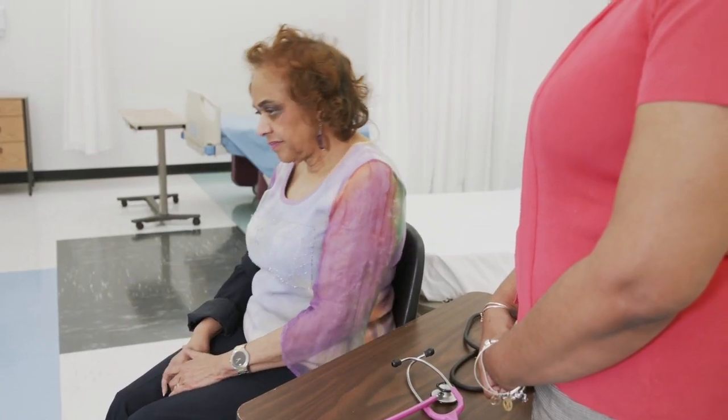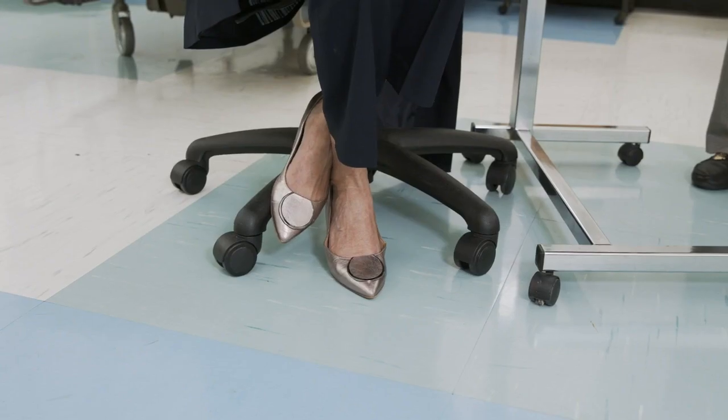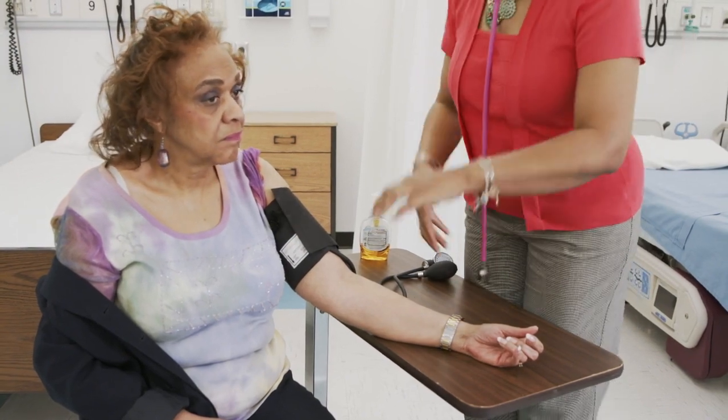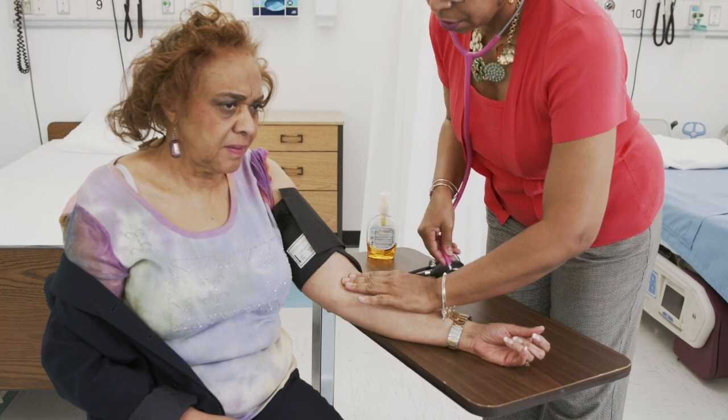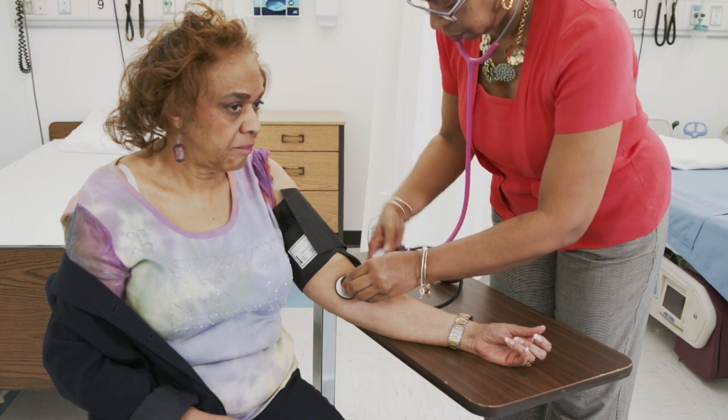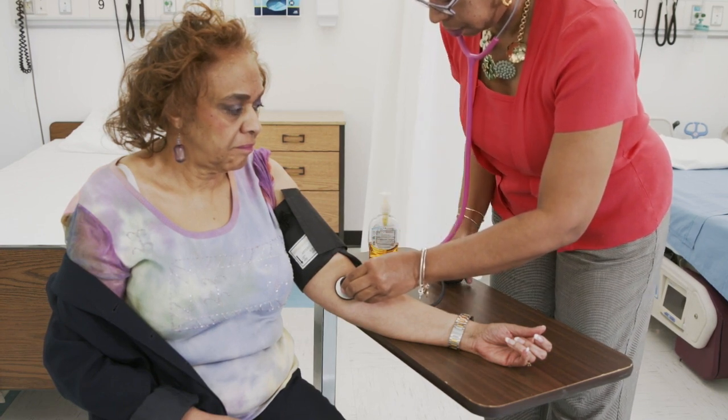You want to ask your patient to sit up straight with their back against the chair and their feet flat on the floor. Next, you insert the stethoscope earpieces into your ears and place the bell of the stethoscope over the brachial artery. You first want to palpate so that you can feel the brachial artery. Place the stethoscope over the artery and you should hear a pulsing — the heart rate, the pulse.